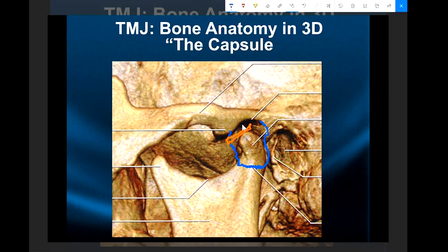So you can inject here and not fill down below, or inject here and not fill above, unless you tear through the meniscus or you tear one of its attachments in the back, which I'll draw now just to be complete, an upper attachment and a lower condylar attachment.